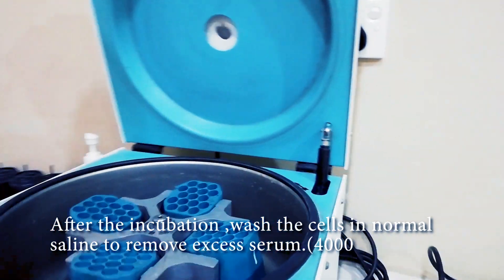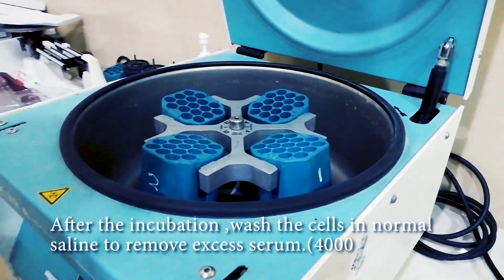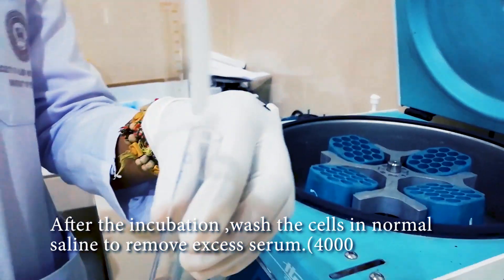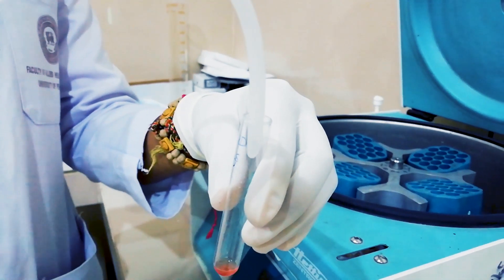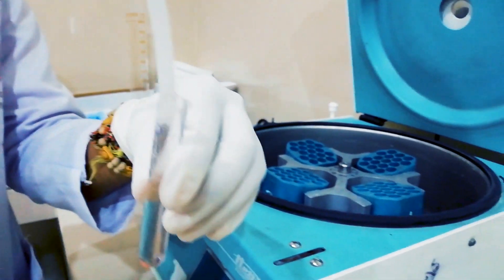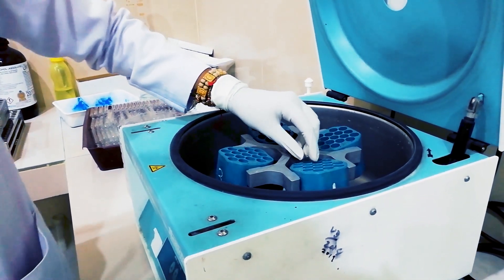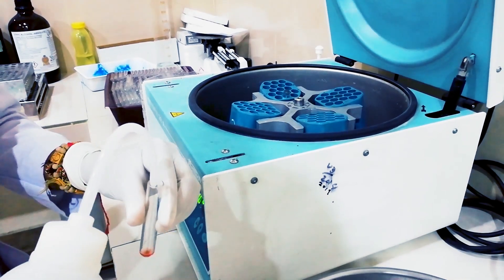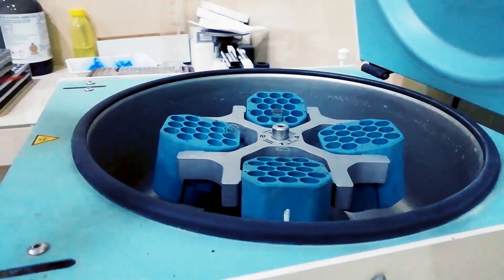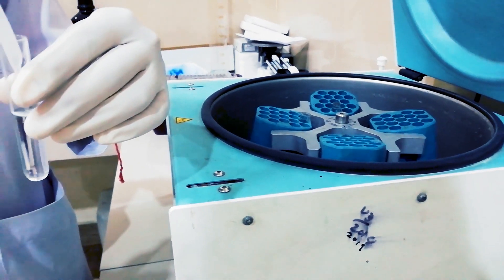For the saline wash, we have to add saline to each tube up to this level. We add this amount of saline and we have to do the saline wash three times. For balancing before centrifugation, we have to balance the weight; we add an empty tube to balance.